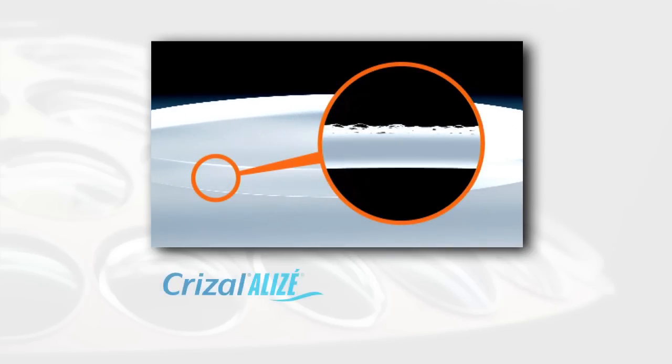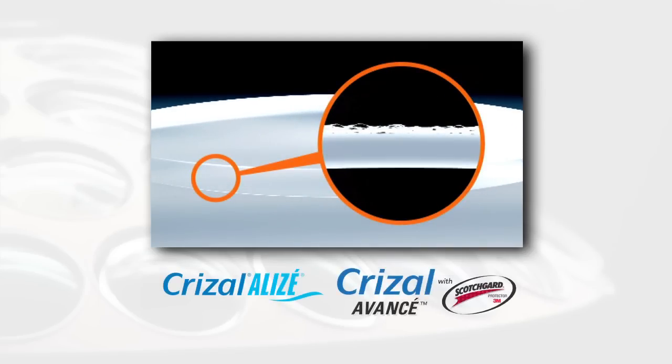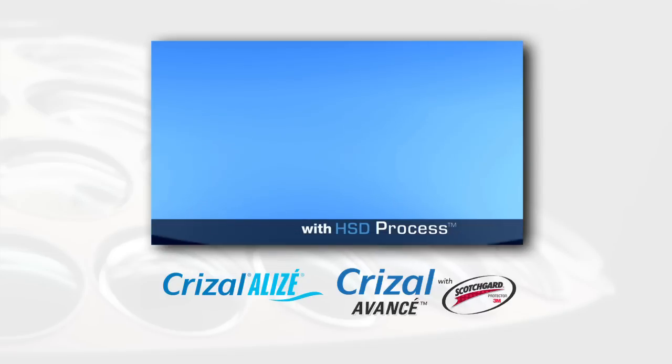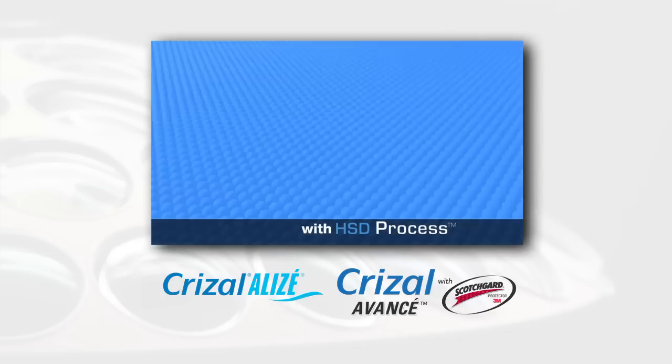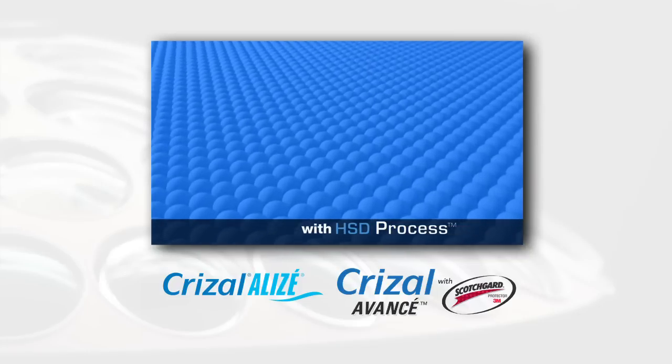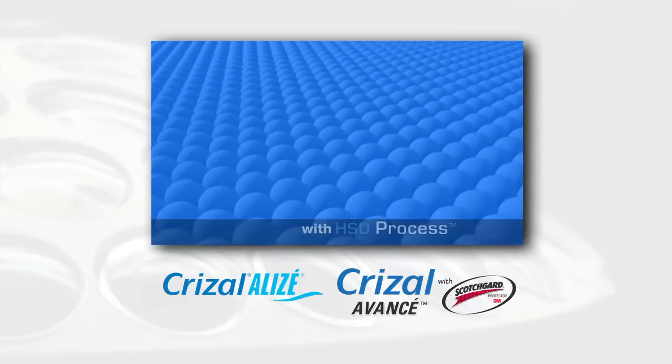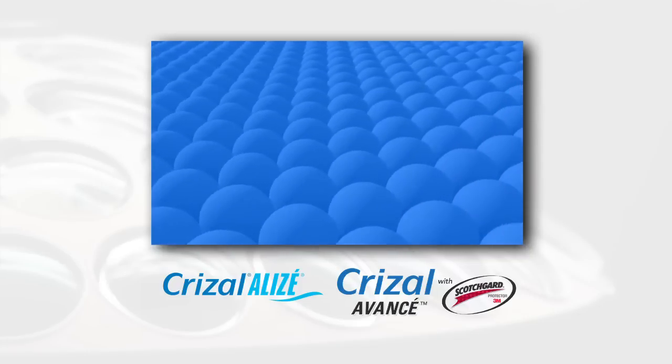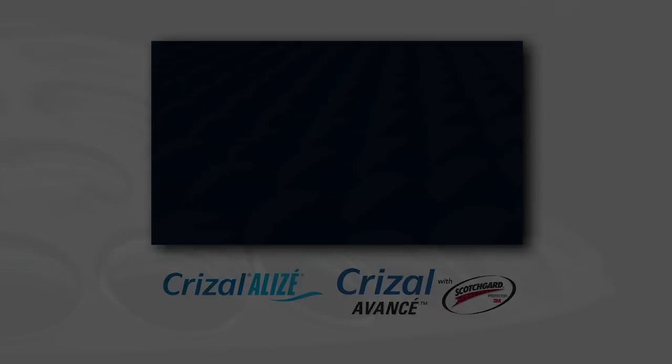Still in the vacuum chamber, Crizal Alize and Crizal Avance with Scotchgard protector lenses receive a super hydrophobic layer on both sides, using our high surface density process to seal the lens surface and make it super easy to clean.